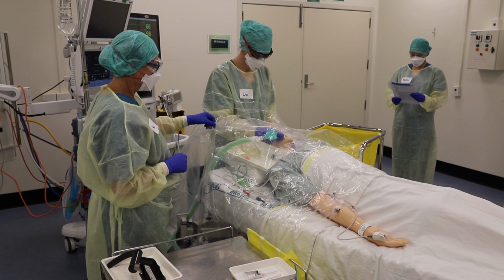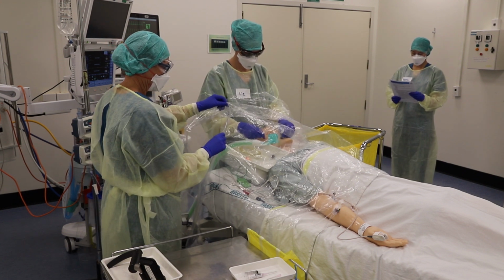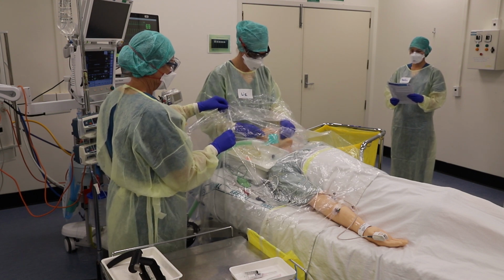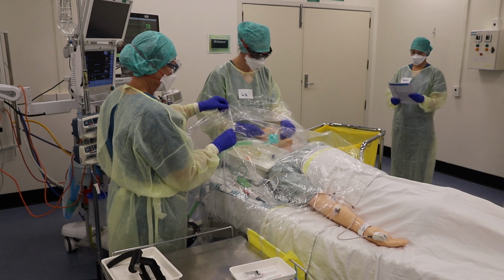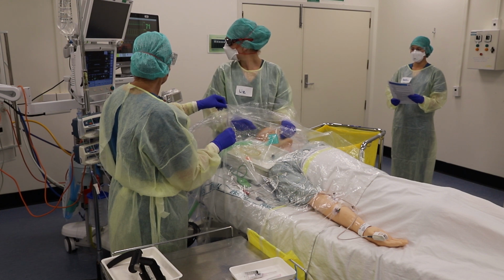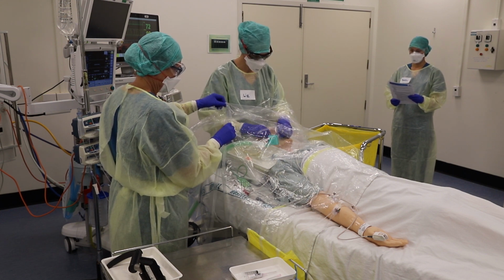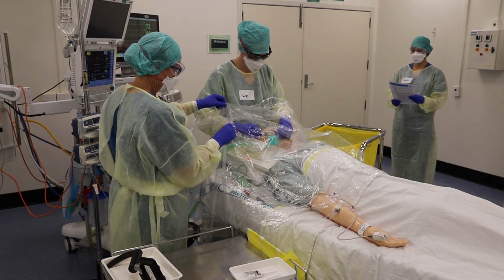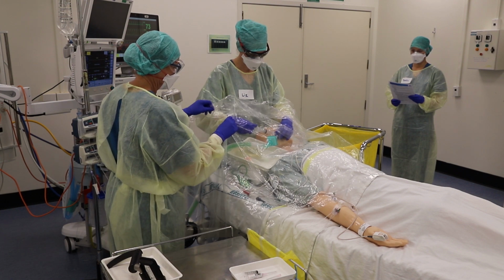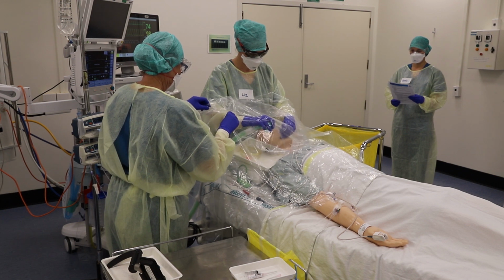When ready, anaesthetist deflates cuff. ET tube is removed and placed into dirty tray on patient's right. Face mask is immediately applied using two-handed technique. Great. Simon, can you just take some big breaths in and out for me? All right, you're doing really well with your breathing. We're just going to take that breathing tube out of your mouth now. Just deflating the cuff now. Just pulling that out of your mouth. Well done.